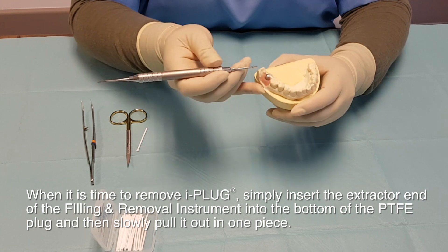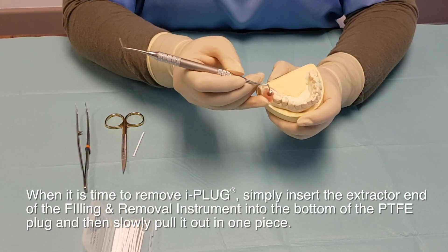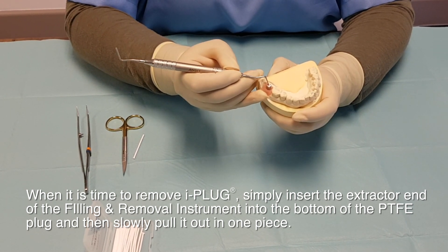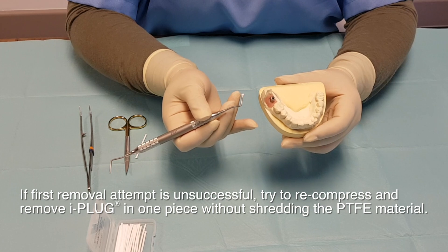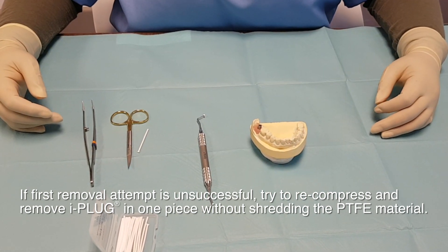When it's time to remove the iPlug, simply insert the extractor end of the filling and removal instrument into the bottom of the PTFE plug and then slowly pull it out in one piece. If the first removal attempt is unsuccessful, try to recompress and remove iPlug in one piece without shredding the PTFE material.